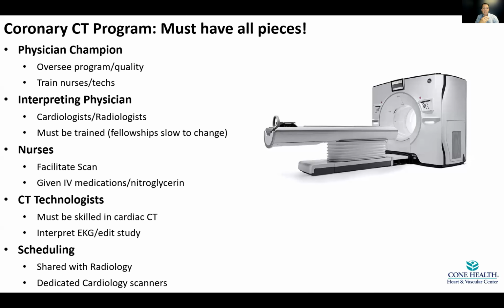You're going to need nurses. They're going to have to facilitate the scan and give IV medications. These patients do get IV beta blockers or nitroglycerin on the table to control the heart rate. And you're going to need very skilled technologists who know how to do this work and interpret the ECGs.